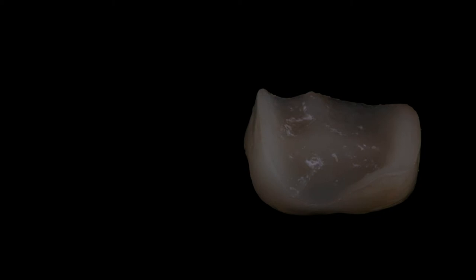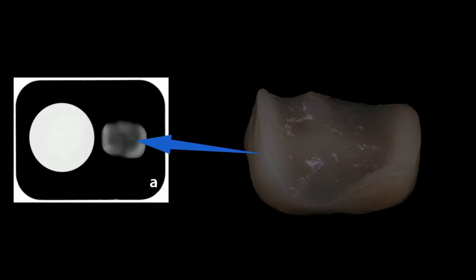This was a de-bonded onlay. The onlay was still in pretty good condition but it had some remnant cement on the inside. It happened to be an Emax onlay. A little pearl: you can check by taking a radiograph of it next to a coin — if it's more radiolucent than the coin, it's lithium disilicate; if it's as radiopaque as the coin, it would be zirconia.